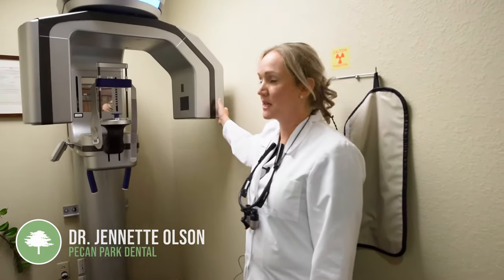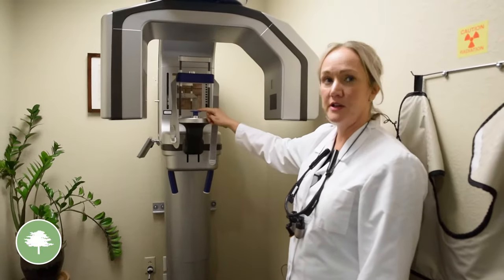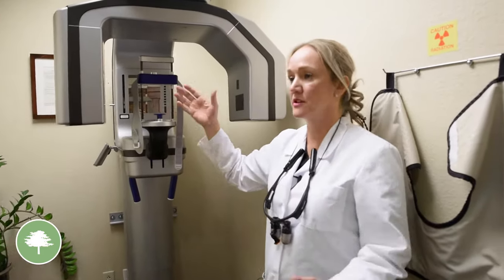This is our CBCT — it's a cone beam technology where you'll stand here and put your chin right here on this device. You'll stand very still and it takes about 10 seconds. What we'll be able to capture is your whole jaw, all your teeth, as well as your airway.